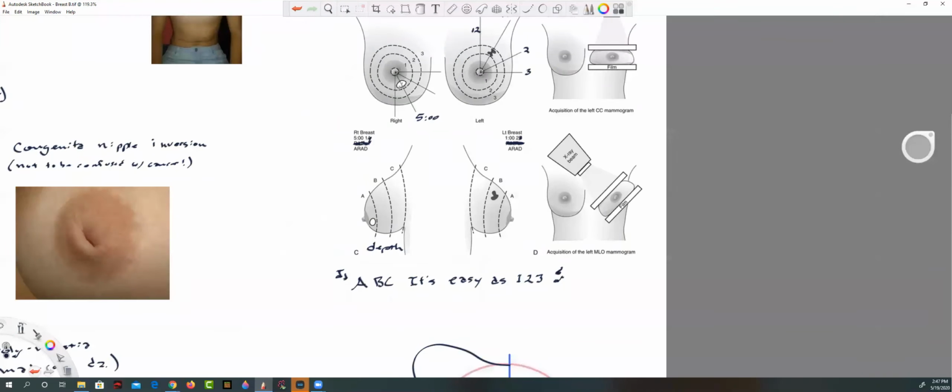So this person has an apparently echogenic circular lesion in the 1 region at 5 o'clock at a depth of A. Now rather than say A, we could say 1 centimeter. It all depends on where you work and what they want you to do. But if we're going to use this nomenclature, this is how it goes.